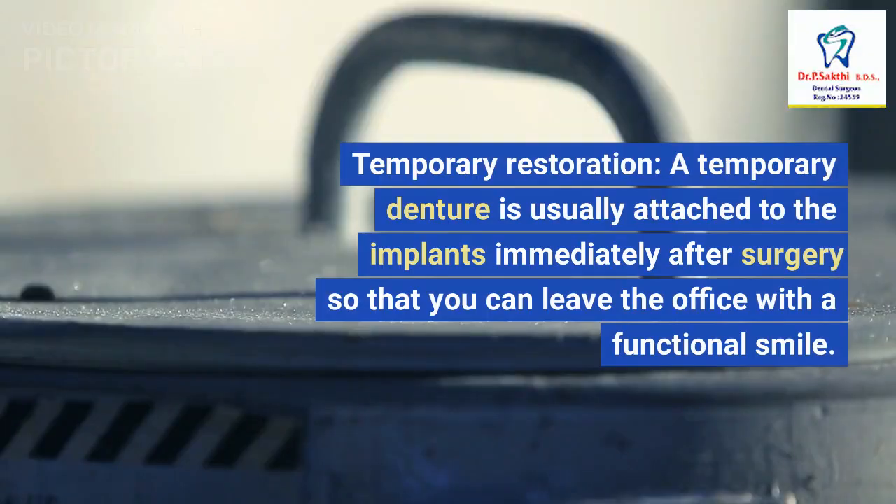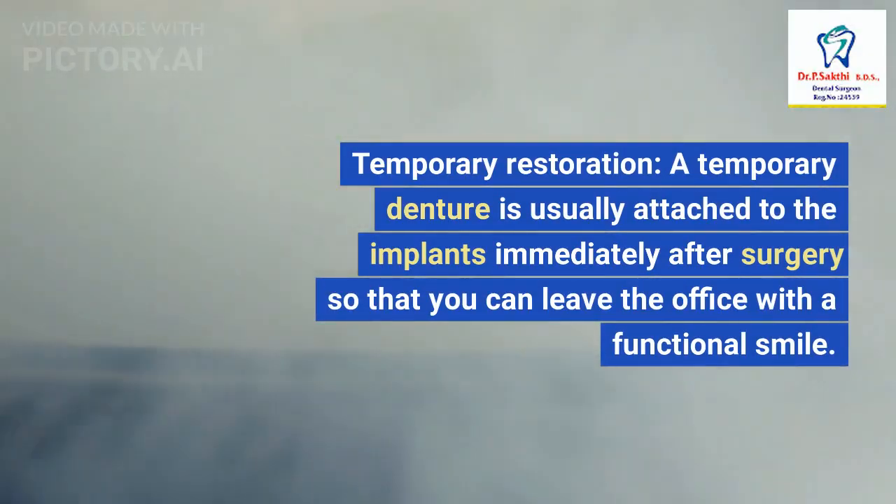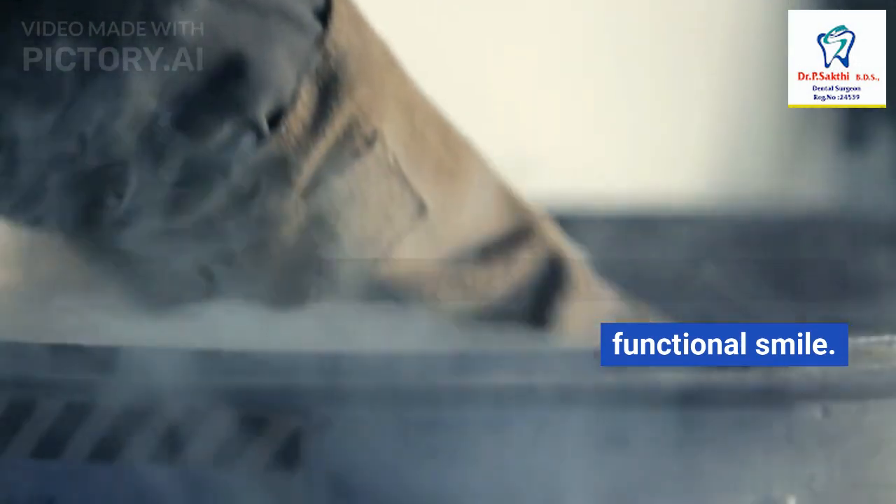3. Temporary Restoration: A temporary denture is usually attached to the implants immediately after surgery, so that you can leave the office with a functional smile.